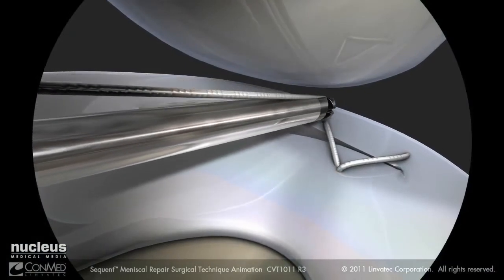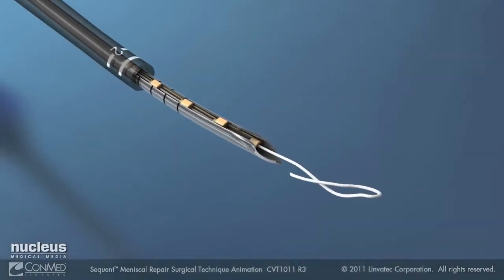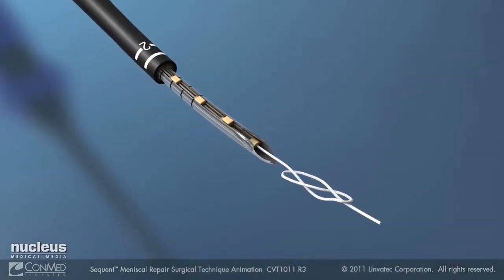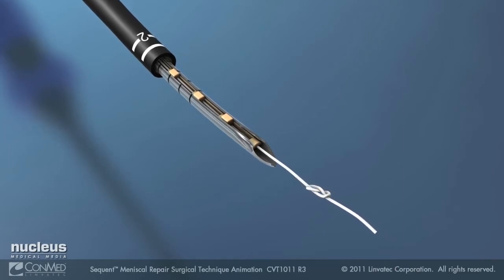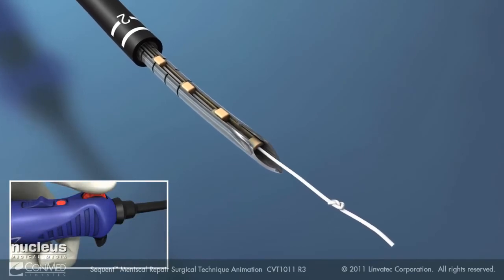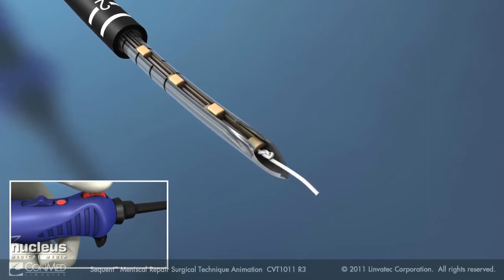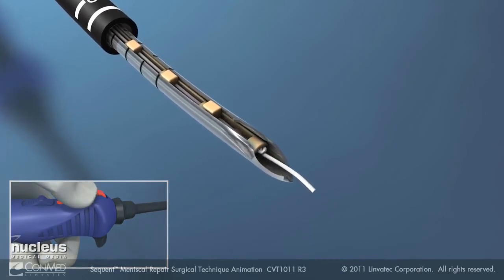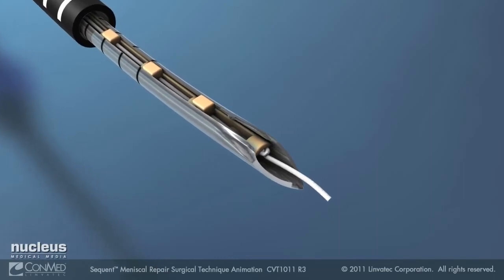Cut the suture flush to the meniscus. Remove the device from the joint and pull out enough suture from the needle to tie a knot. Tie a figure of eight, leaving approximately 10 millimeters of suture tail. Move the switch back to the ratchet position and reel the suture so that the knot is drawn into the starting implant. The device is now reset.